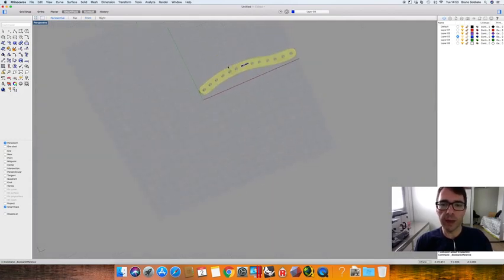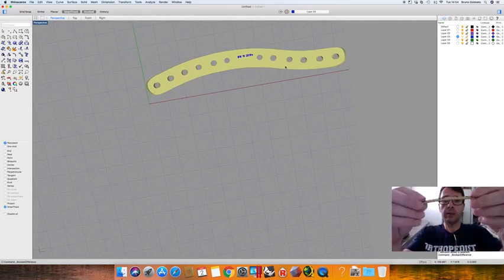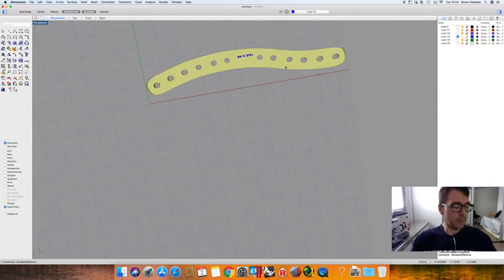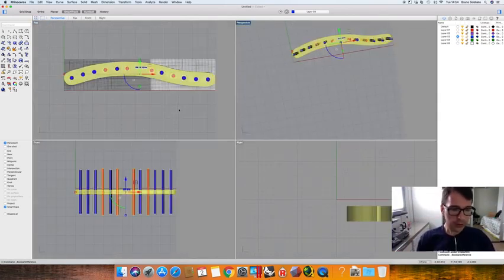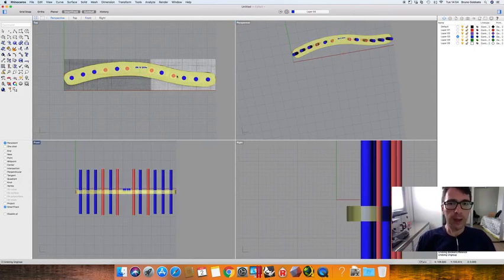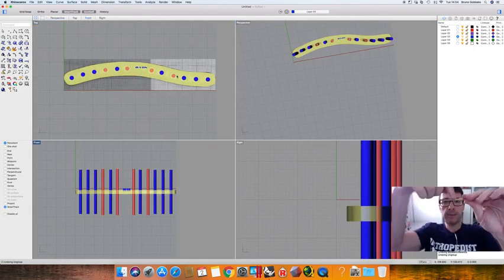If you have a 3D printer like I do, like my printer's right here, we can 3D print and make sure that that implant is in correct position as the right implant, as the original implant. Another important feature, I'm going to go back, is that some locking screws have different positions.